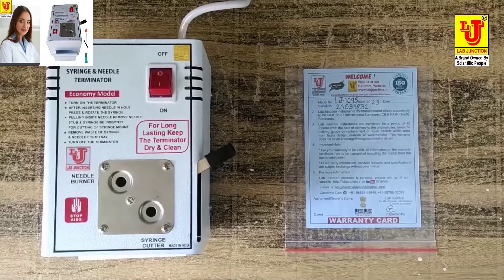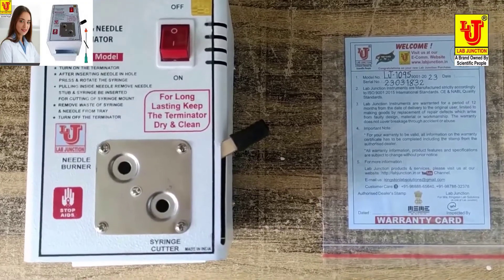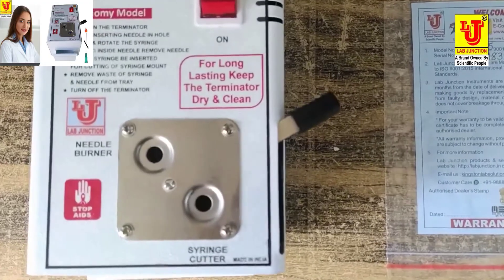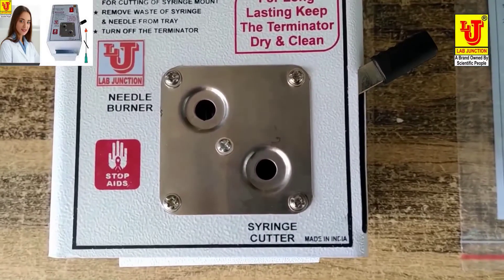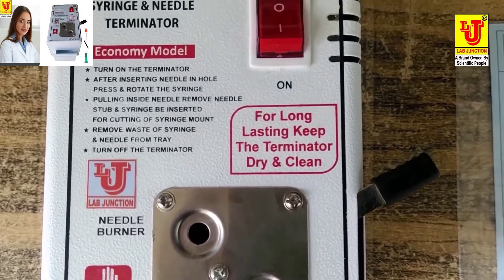Lab Junction electrical needle destroyer machine, surgical syringe cutter. Copper metal body, shockproof, low power consumption, portable on/off switch. Hospital and laboratory use. LJ1095 as per quality standards.